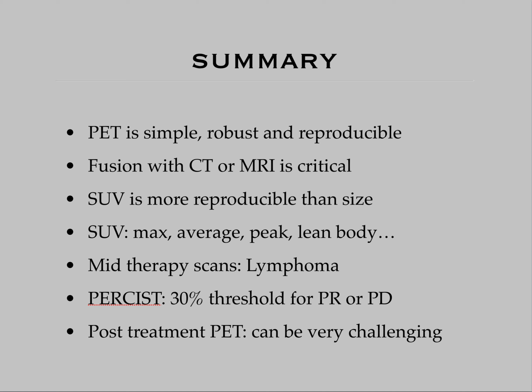The concept of mid-therapy scans, again, revolutionized lymphoma. PERCIST, again, fantastic proposal with simple guidelines that are relatively easy to follow, but this needs to be validated to become more usable. Post-treatment PET these days has become much more complicated because of inflammation from radiation, as well, of course, as immunotherapy introducing new challenges, but that requires several additional lectures to explain, so stay tuned.